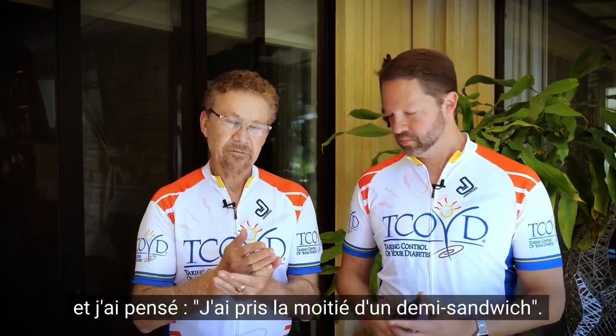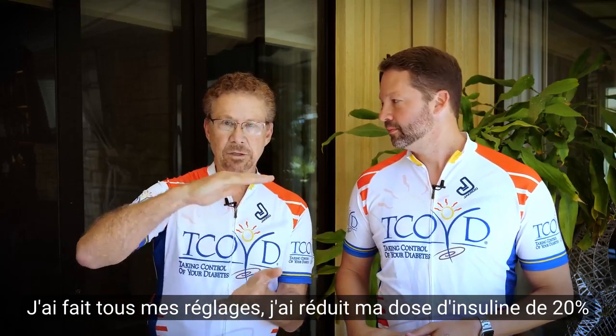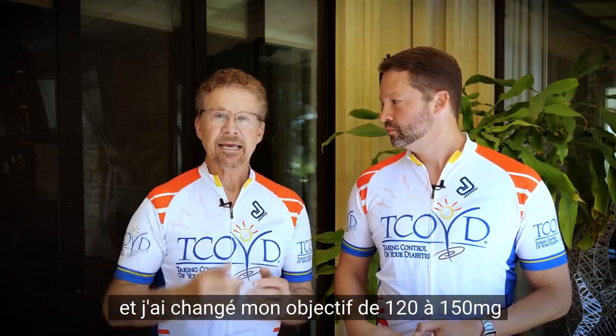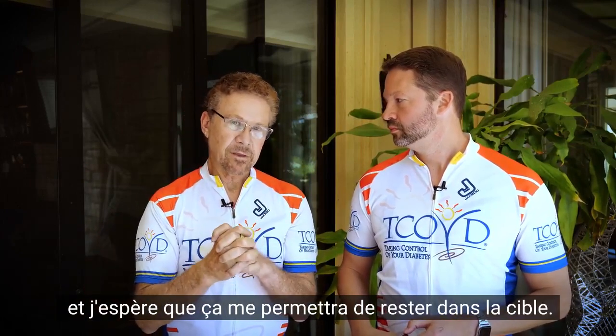We wanted to check back in real quick with what our blood sugars are doing. So Steve, you want to go first? Your update? Sure. I started off at 106 about an hour ago, and I thought, well, I had half a sandwich. I made all my settings, reduced my insulin delivery by 20%, and I changed my goal from 120 to 150, and hopefully that keeps me in range.